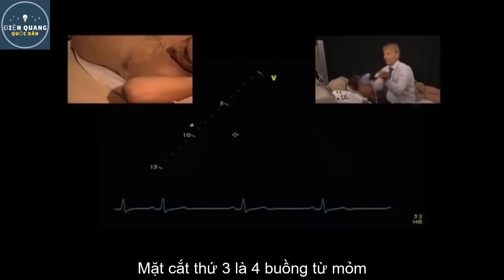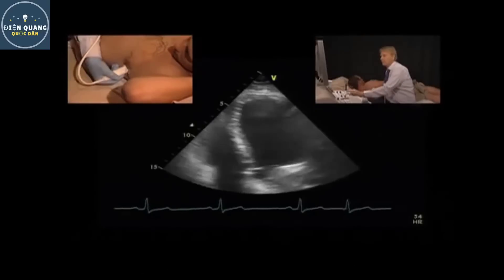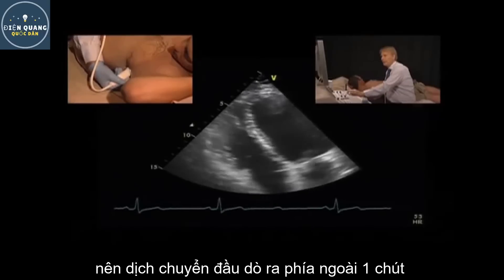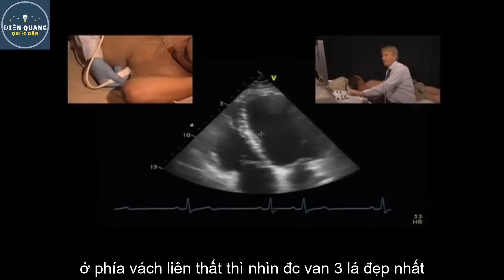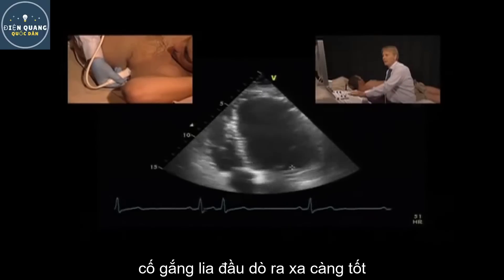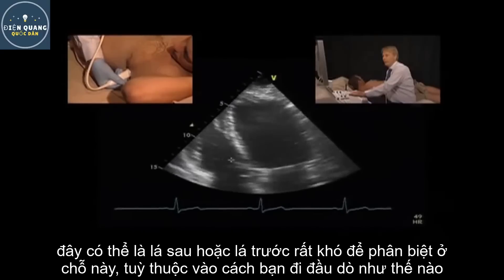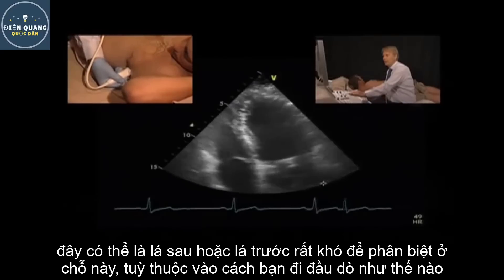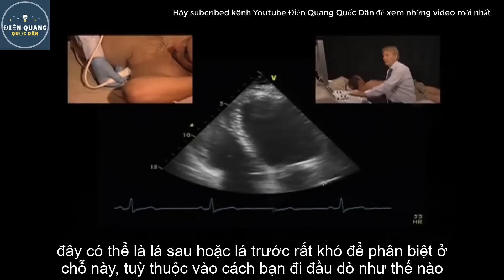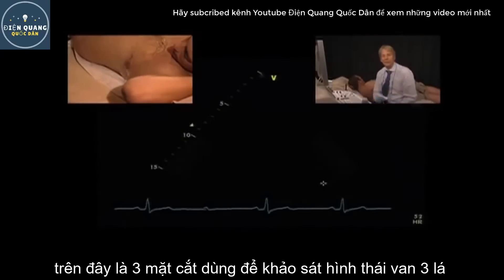The third view is the apical four-chamber view. It is advisable to move the transducer further lateral and to tilt the septum — you can usually get a much better delineation of the tricuspid valve that way. Try to bring the transducer as far as you can in the middle of the sector. Here you have the septal leaflet, and this would be either the posterior or the anterior leaflet — you cannot tell simply because it depends on how much you tilt the transducer. If you go further down it would be more the posterior; further up it would be the anterior leaflet. By these three views it is possible to assess the morphology of the tricuspid valve.